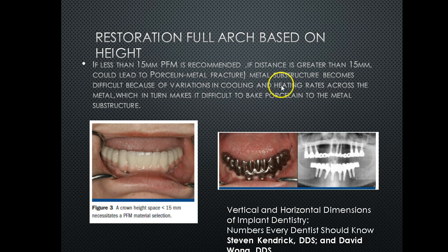The reason for that is because of the metal substructure. Because of the variations in cooling and heating, it could be difficult for the lab to bake the porcelain on the metal substructure.